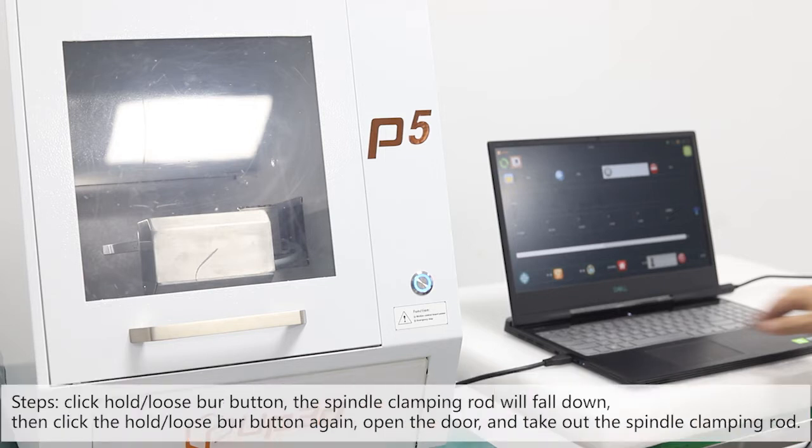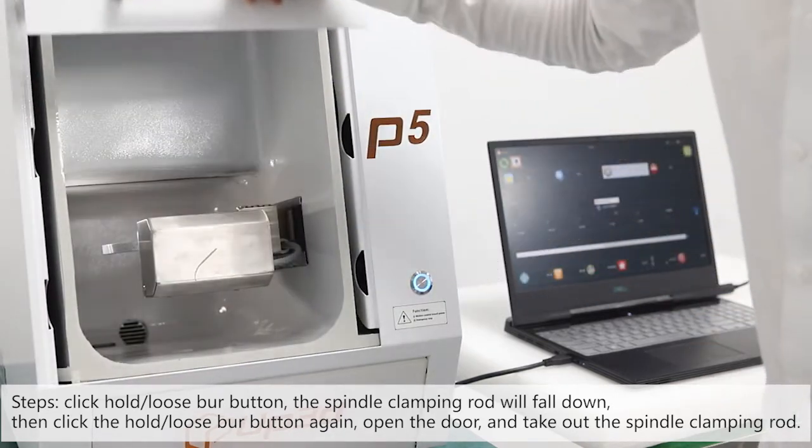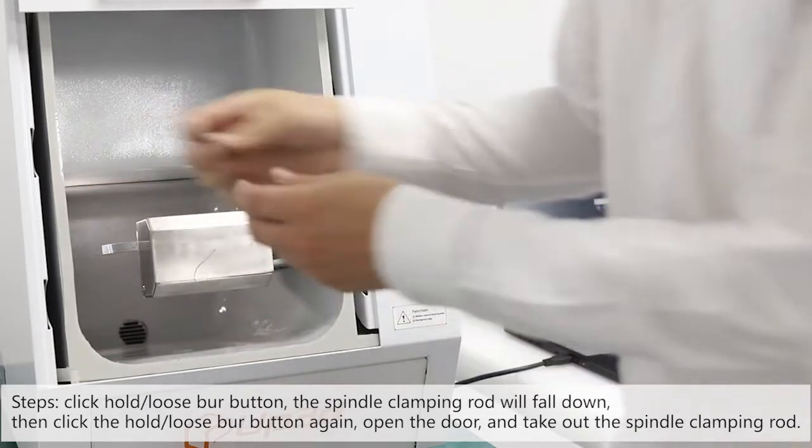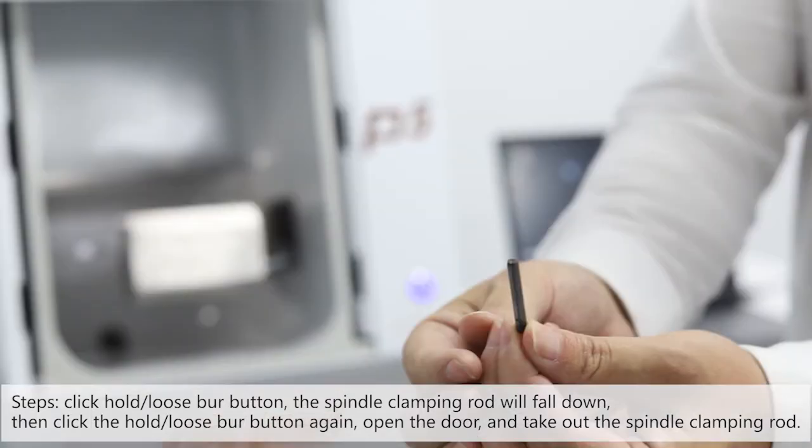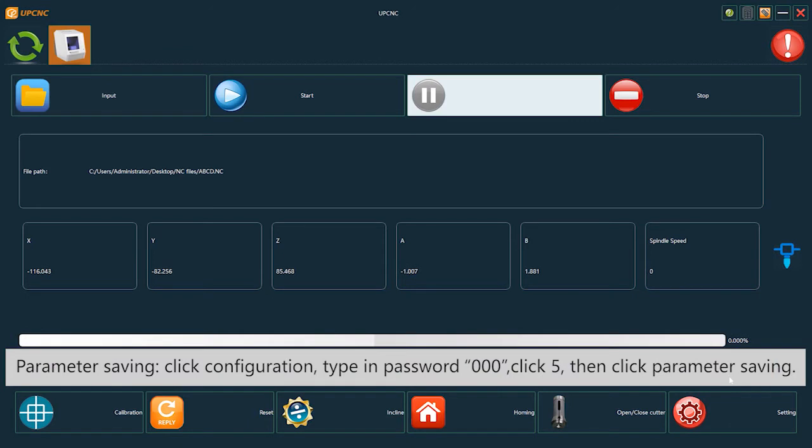Click the hold loose burr button. The spindle clamping rod will fall down. Then click the hold loose burr button again. Open the door and take out the spindle clamping rod.